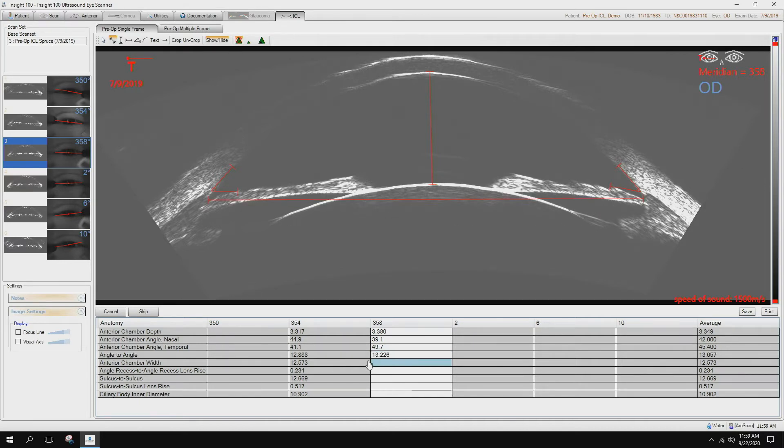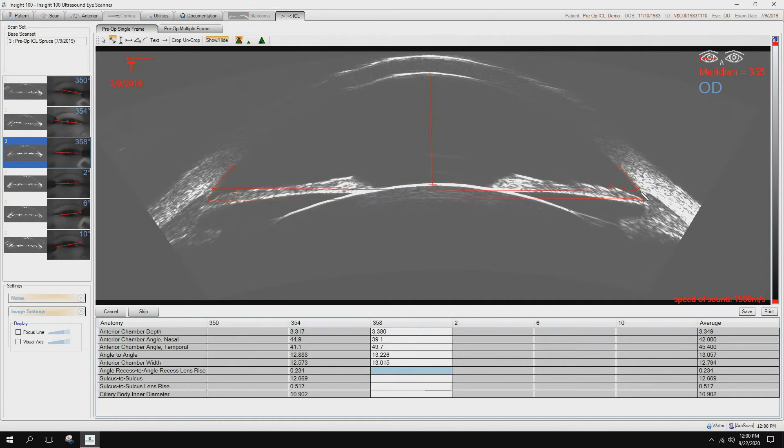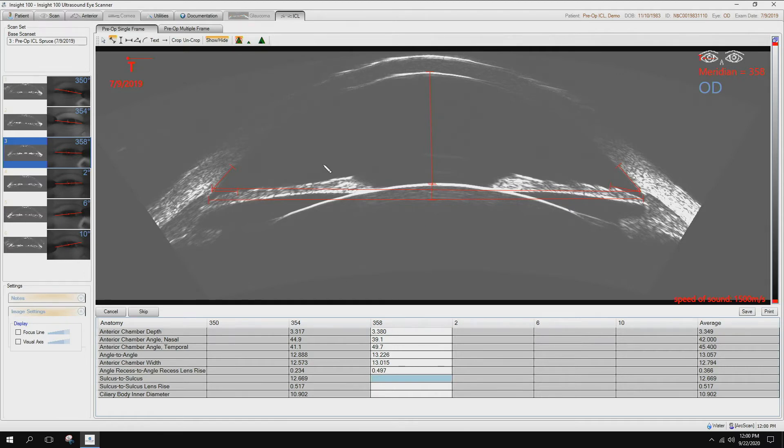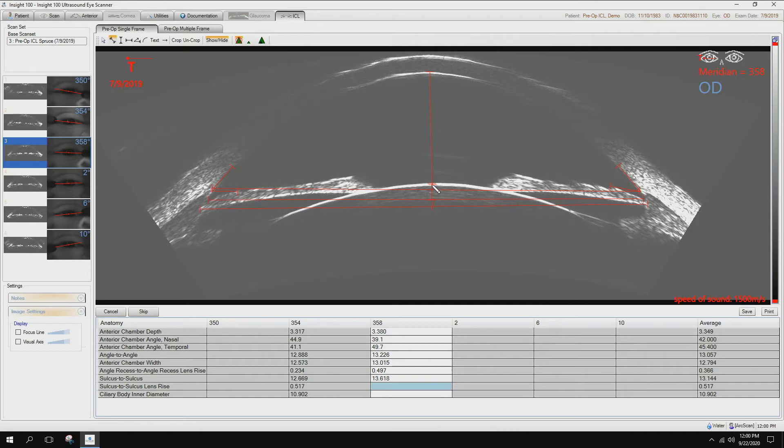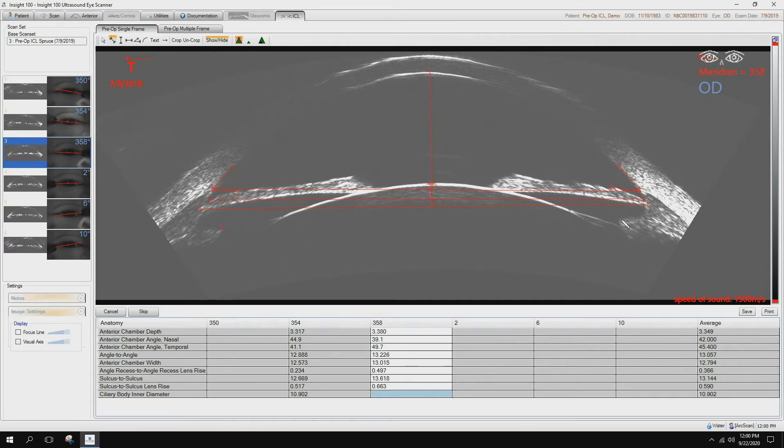Then we can always look over here to see which is the next step. Anterior chamber width, again, scleral spur to scleral spur. Here's the recess lens rise. Sulcus to sulcus, again, the pigmentation to the pigmentation. The lens rise, again, from the sulcus to sulcus line. Ciliary body inner diameter.